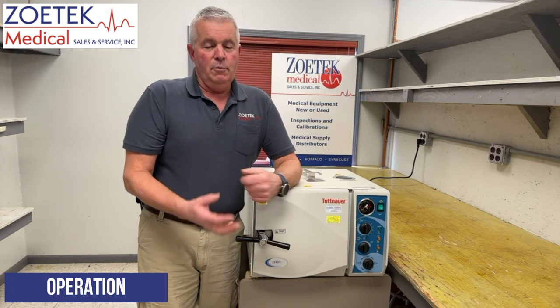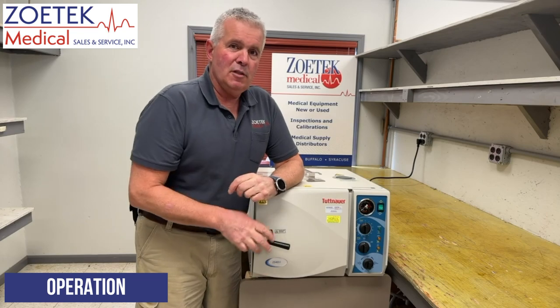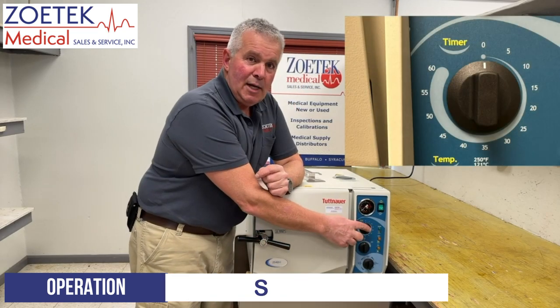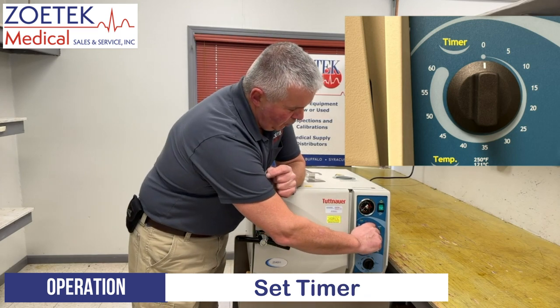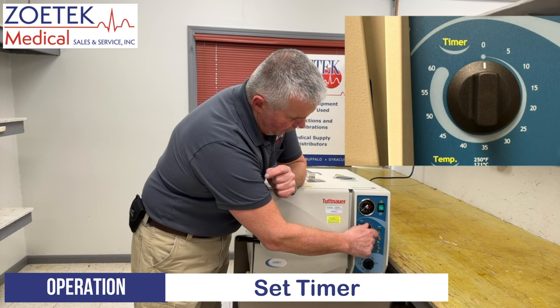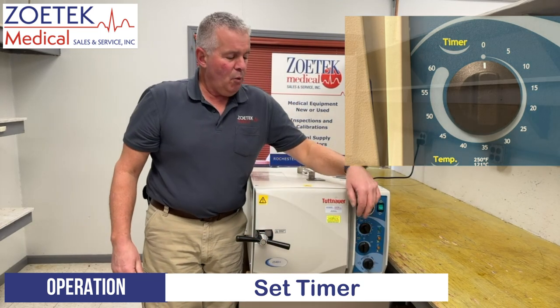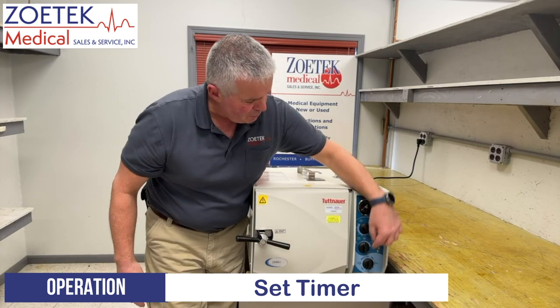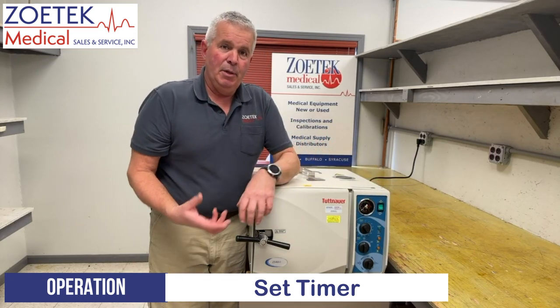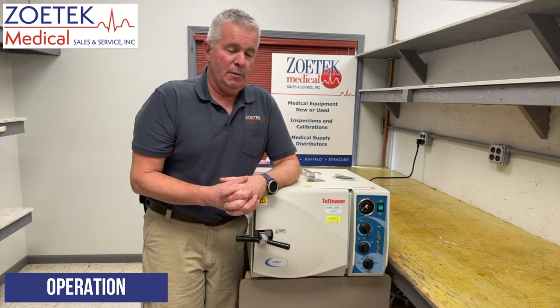You would also refer to whatever your facility uses for the sterilization time. Once you have your temperature set, this top knob is our timer and we can turn it to whatever time we want — say 20 to 30 minutes. At that point we have set our timer; the heater will start and it will heat up whatever you have in there to be sterilized.